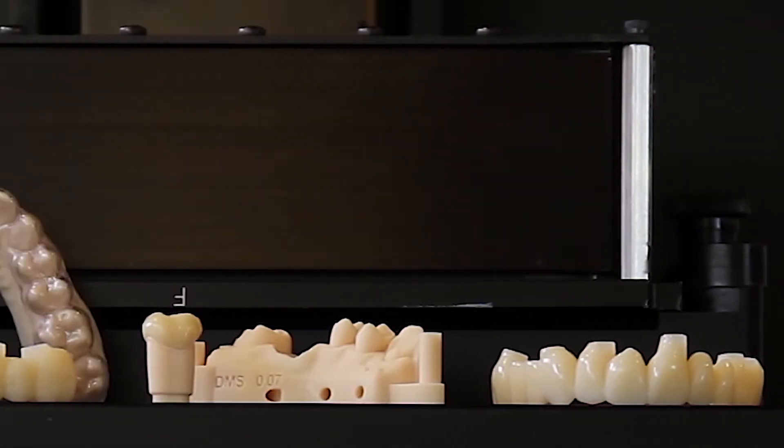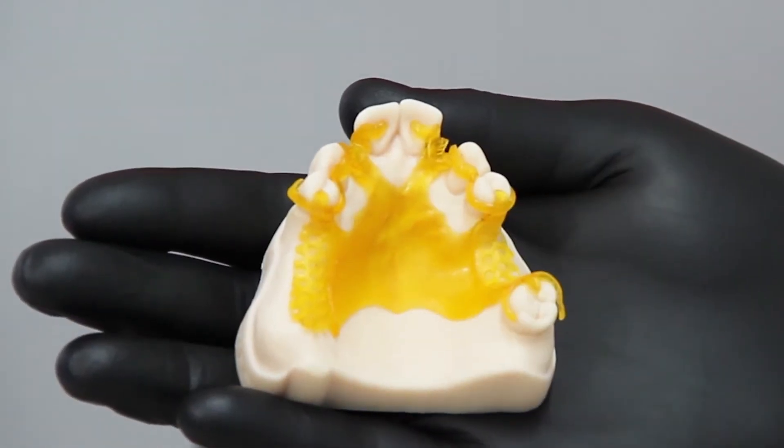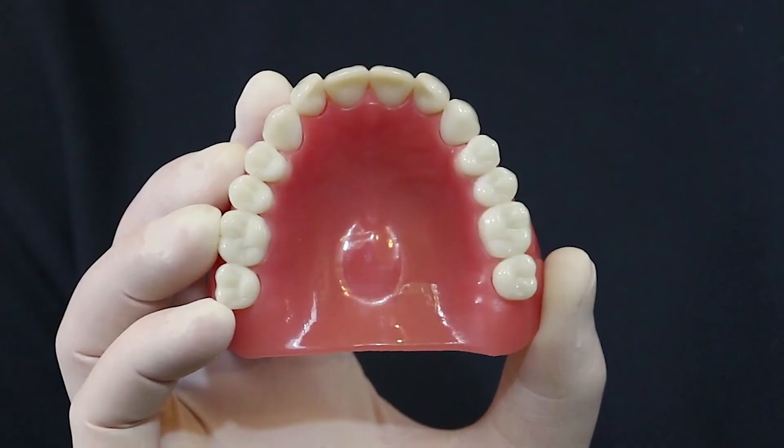With the Vita, you can actually print anything you can imagine. We can print models, copings and metal framework partials, night guards, implant surgical guides, temporary crowns, wax crowns, and even dentures.